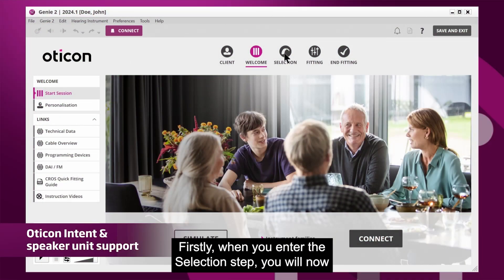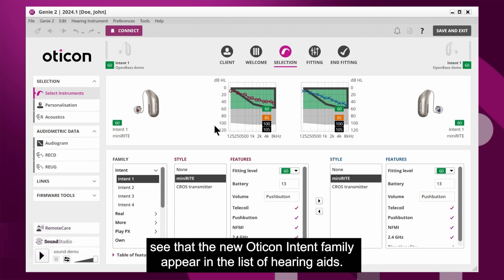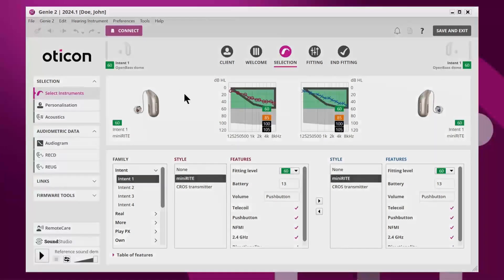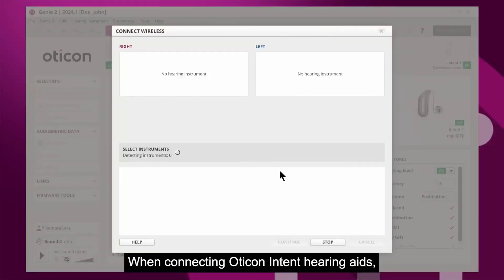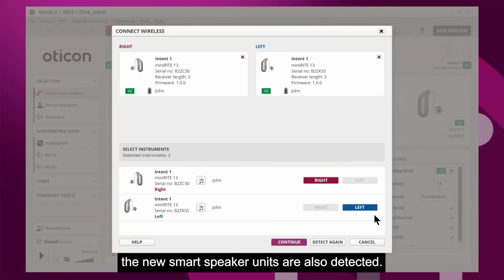Firstly, when you enter the selection step, you will now see that the new Oticon Intent family appear in the list of hearing aids. When connecting Oticon Intent hearing aids, the new smart speaker units are also detected.